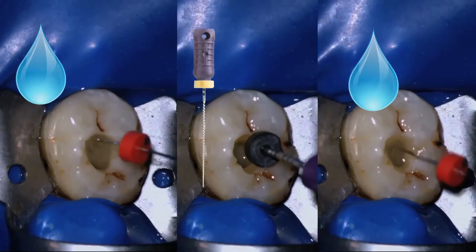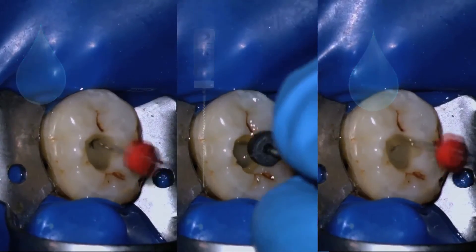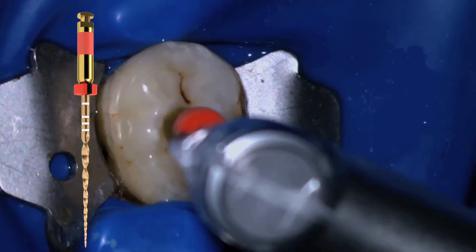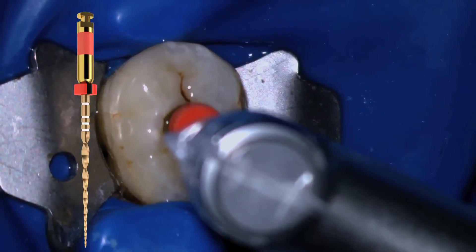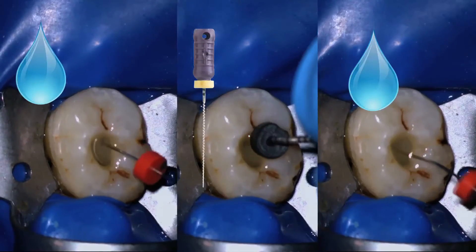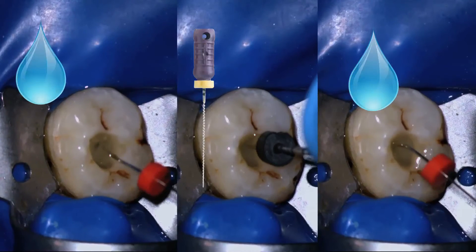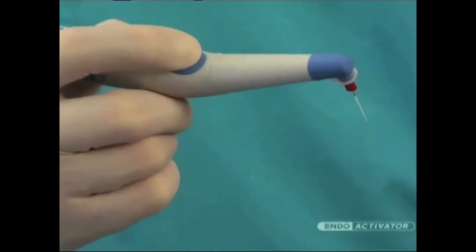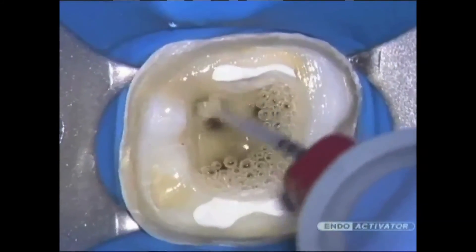We continue with amplitude strokes of three to four millimeters, irrigating and making sure we have not blocked ourselves, until we reach working length with WaveOne Gold. This was the last step of WaveOne Gold use — the canal has now been prepared. We irrigate thoroughly, confirm the canal has not been blocked, and then proceed to use the EndoActivator to remove the smear layer before obturation. We use solutions such as Q-Mix in conjunction with the EndoActivator.